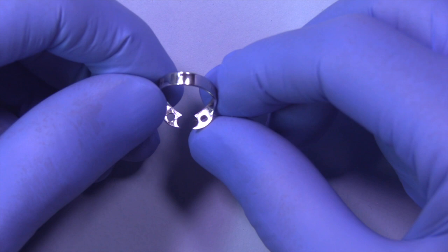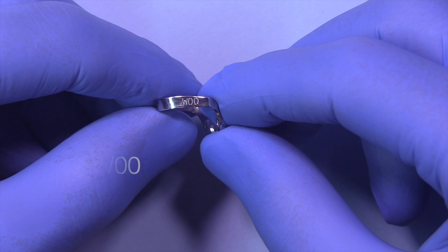And then finally I've got this little W00, which is a wingless 00 and it's great for anterior teeth. So that's the set of the basic wingless clamps.